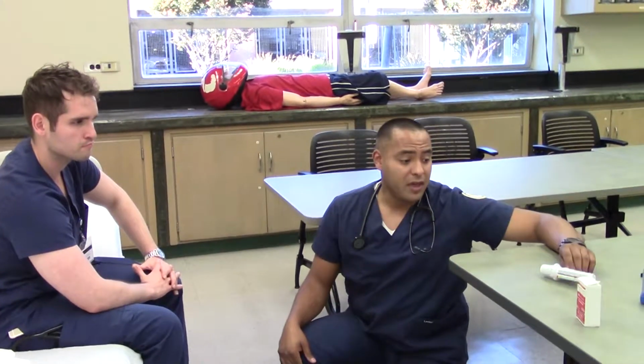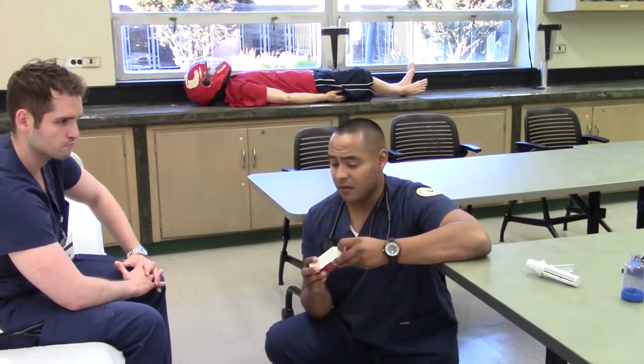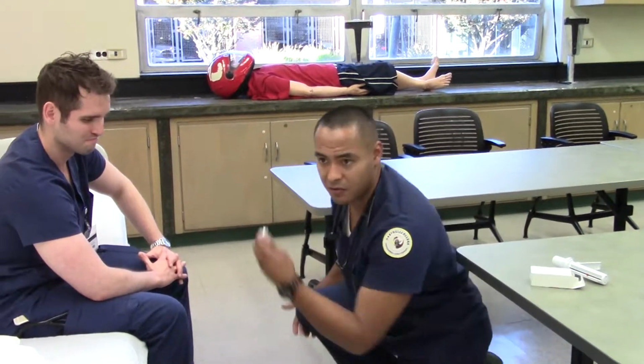Then from there, you go ahead and teach the patient about, you know what, I'm gonna, okay. I feel like I just want to give it to him because he's having distress, but I'll go ahead and talk about it before I give it to him. I'll watch him struggle breathing. No, I'm kidding.